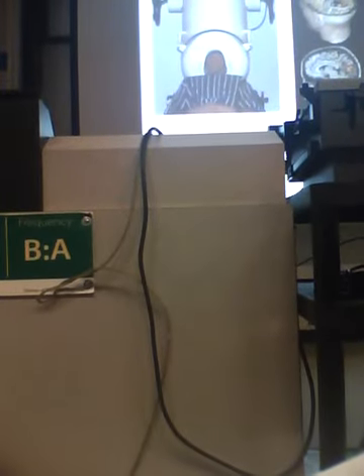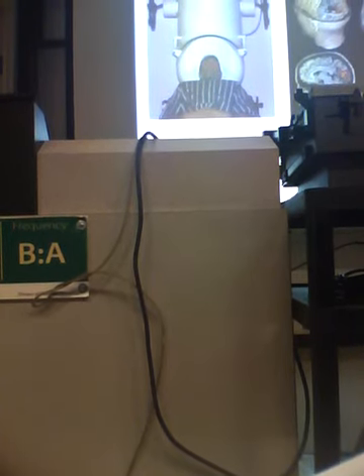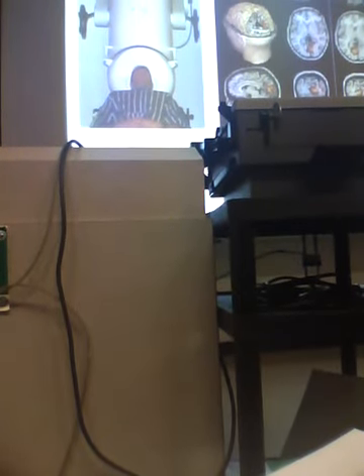So here's the subject with his head in a special place, and there's all sorts of contraptions to detect these magnetic fields in his head. This thing is about 3 stories high. You can see the bottom part of it here, but it's a colossal, enormously expensive machine.